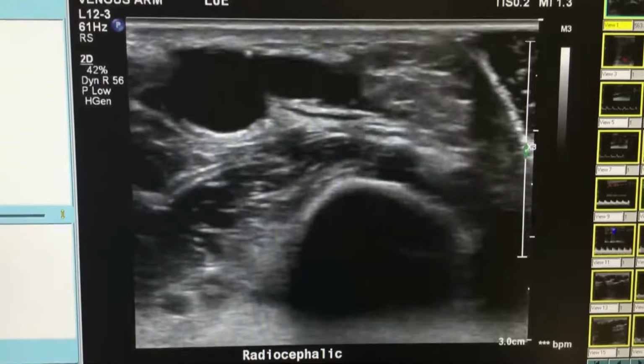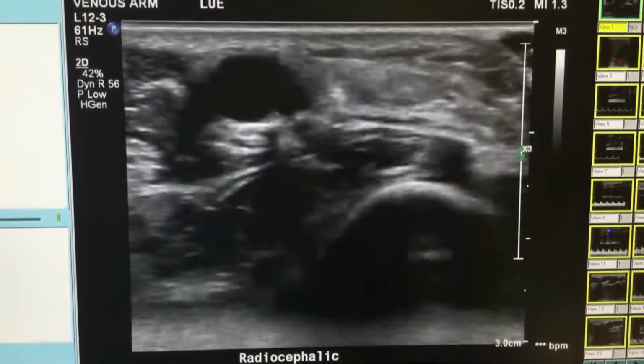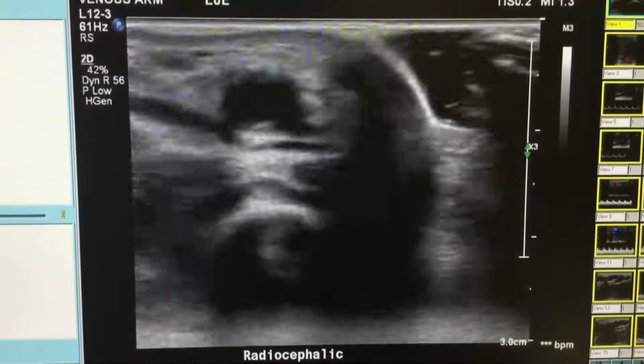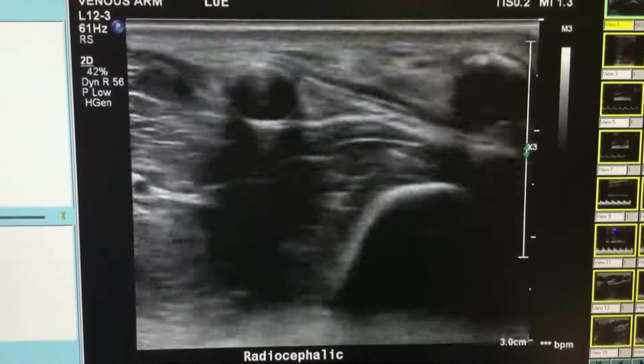So there we're looking at the anastomosis, we're following this fistula up, and what we can see is that there's some aneurysmal areas, and it's kind of diving back and forth and moving side to side on the screen. That just tells you this is a fairly tortuous fistula, and if it's deep in areas, that's going to be hard to hit. You can imagine that the more aneurysmal areas are the areas that they've been able to favor and find easily.